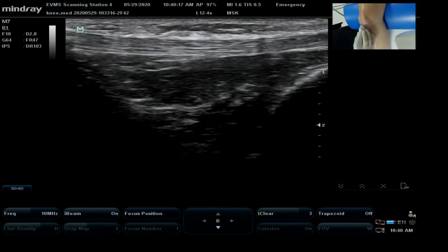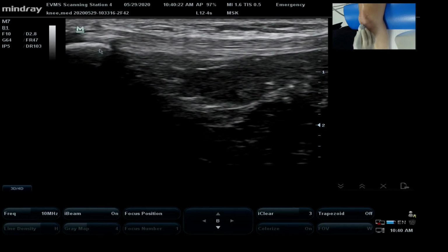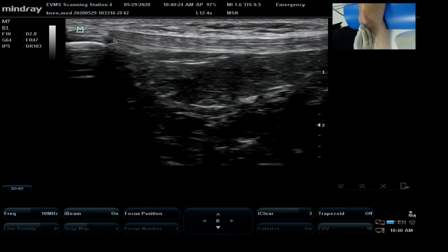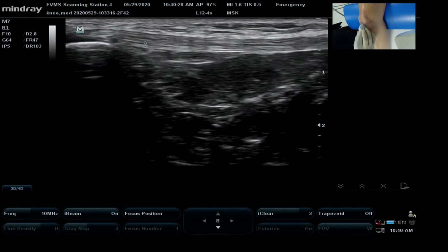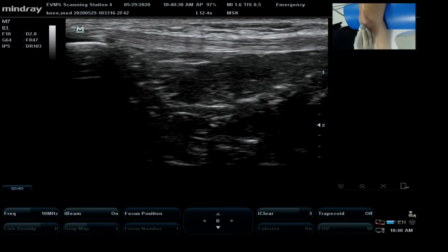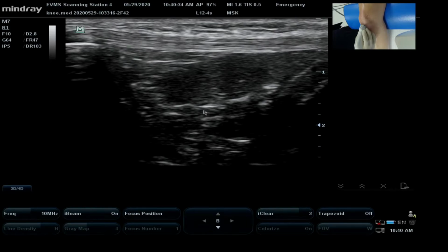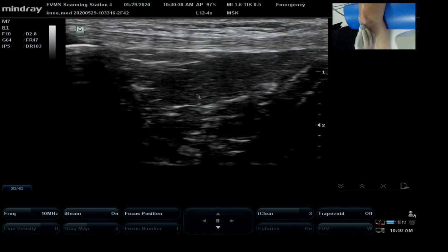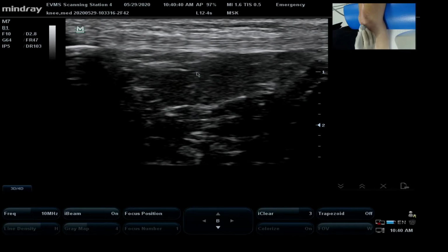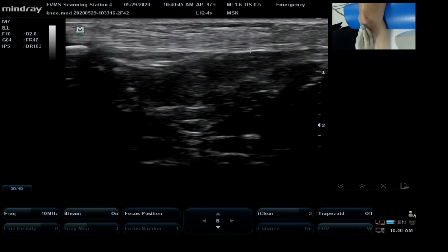I'm going to move proximally to bring in the kneecap or patella, and you can see the patellar tendon's attachment to it, and we see subcutaneous fat here, that protective fat, and then we see that heterogeneous fat that sits below the tendon, which is Hoffa's fat pad. This fat pad is protecting that area in there between the joints.